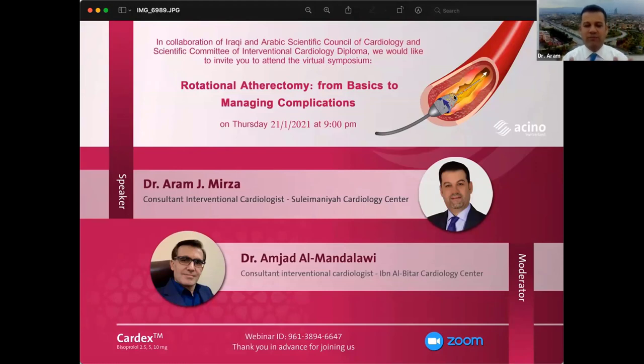Just to add to you, Dr. Amjad, when you have got this calcified lesion, there's a lot of calcification on the screen. As if you have got a roadmap, you don't even need contrast to see whether you crossed the lesion or not, because it is so clear to your eyes. You can see the calcification on fluoro. When you push it, you can see without the contrast whether you have crossed the calcified area, because the calcification is so clear on the fluoroscopy.